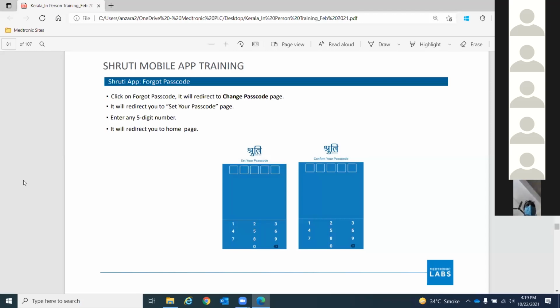Yes. But it's better, if you have used the device, to switch it off and then place it on charging, and then you can switch it on. But there is no problem if the battery is low and you are putting it on charging. The charge is not lasting even 3 days. Even if we are not using the device, the charge is getting drained out soon.